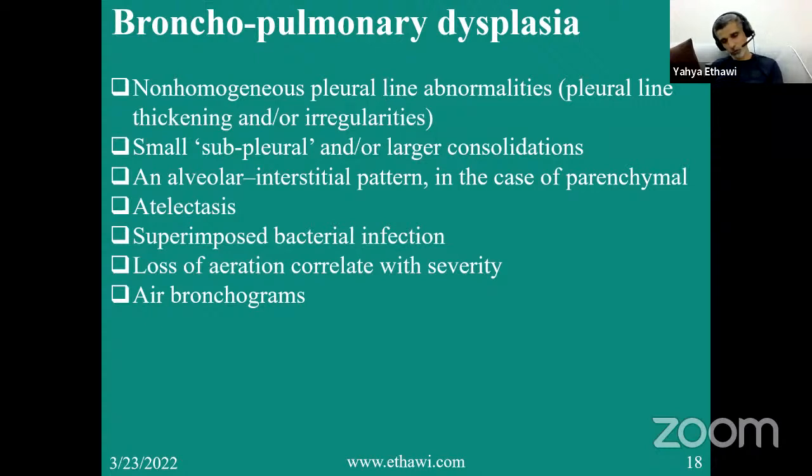If you want to diagnose the new one, then you need to look at the pulmonary valve, look for doming and thickening, and measure the pulmonary acceleration time, and then you get the ratio from the whole cardiac cycle. If it's less than 20%, or 20 to 30, or more than 30, it gives you the severity of pulmonary hypertension. Because at that age the tricuspid jet might not work, and also the PDA is closed, you have only one way to measure the pulmonary pressure.